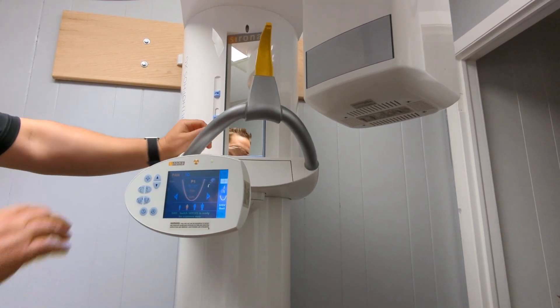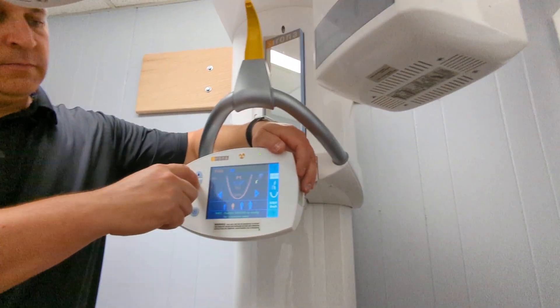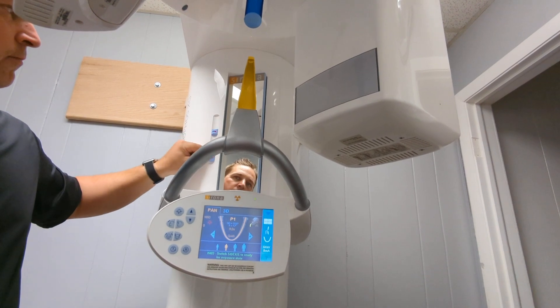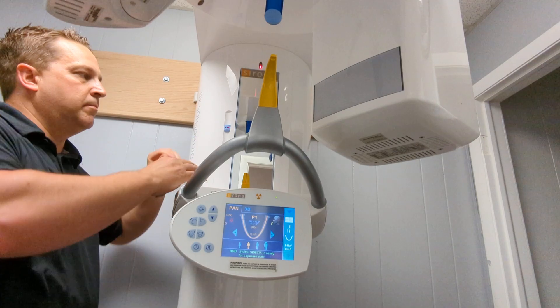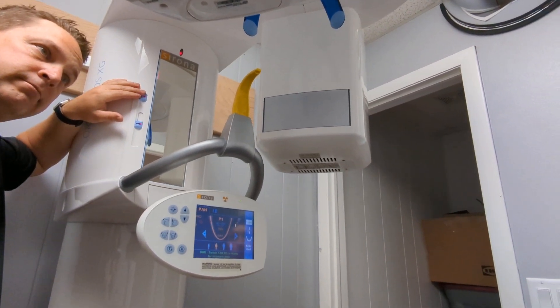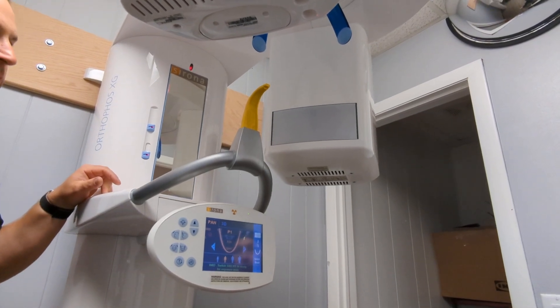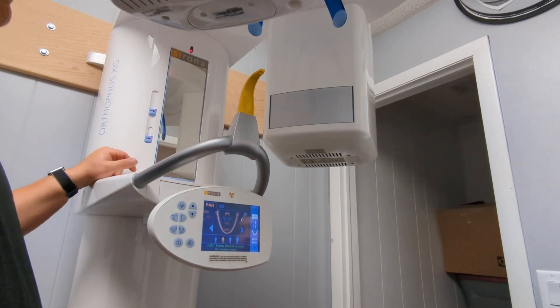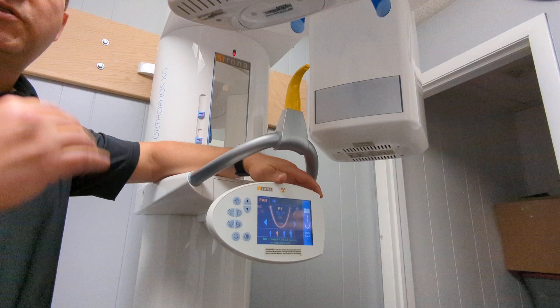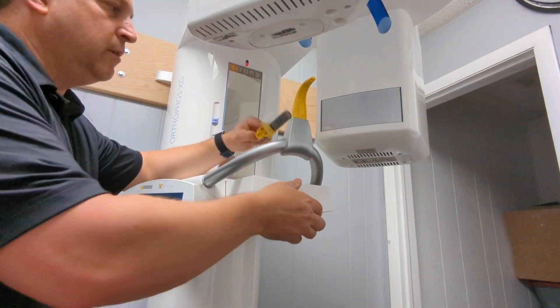So for panorex — up/down elevator buttons. You can put a damper on that beeper because it's loud. There's a laser light right here that tells you up and down. You see these laser lights — you see the two lines — whatever is in between those two lines is what you're imaging on 3D. Just make sure they're in between that line. Those lasers are just markers; they don't control where the x-ray unit goes. You just have to make sure you put the patient in between. Line them up and if they're off you know to adjust.